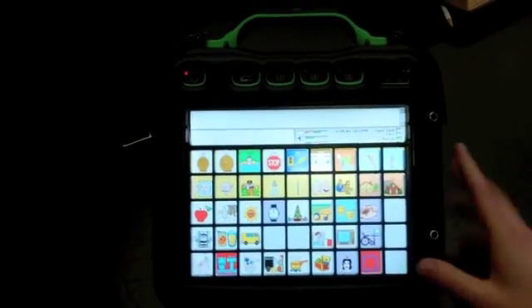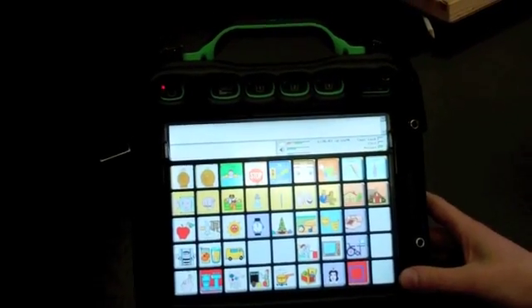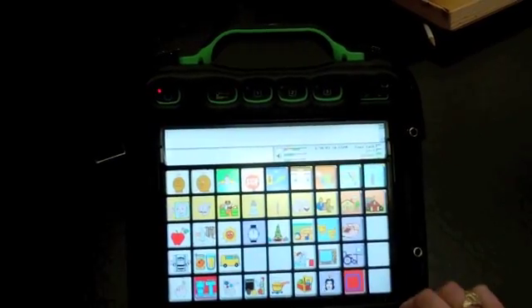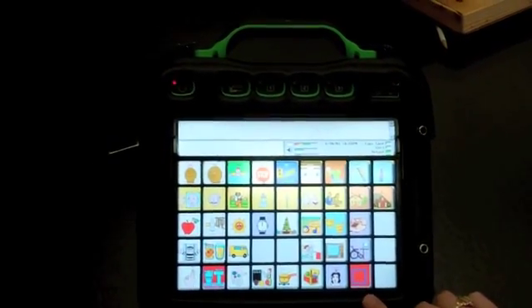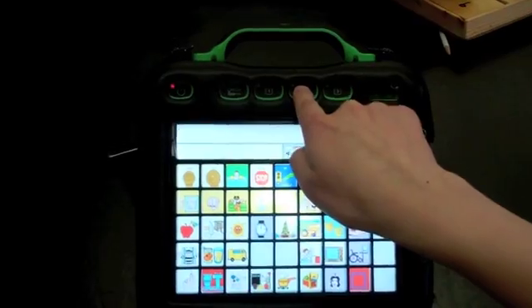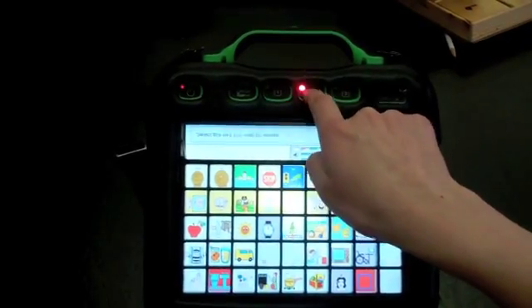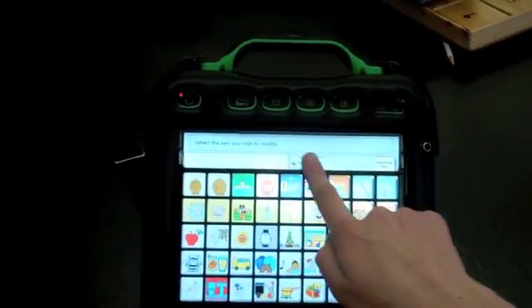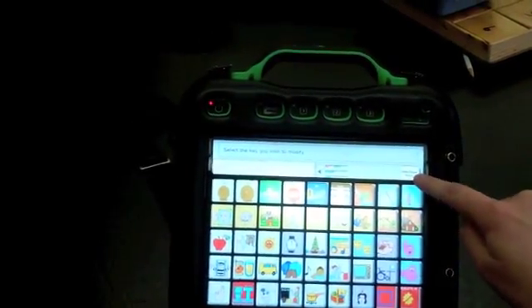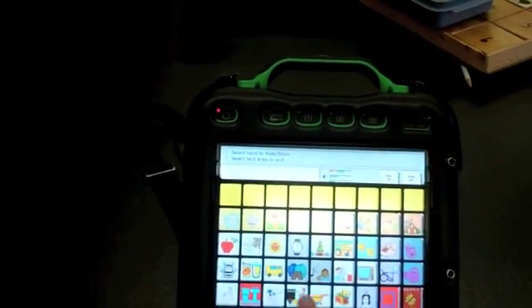Okay, so I'm going to show how to hide buttons, hide sequences on the Vantage light. So to do that, you would press the tool setting button, and it will put right here, hide or show keys. When I click hide or show keys.